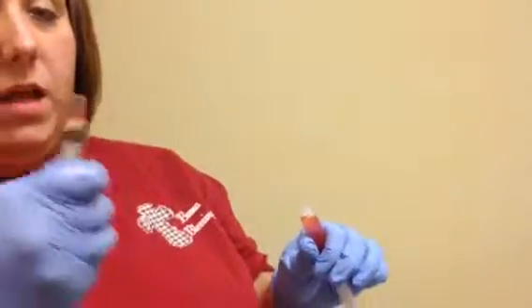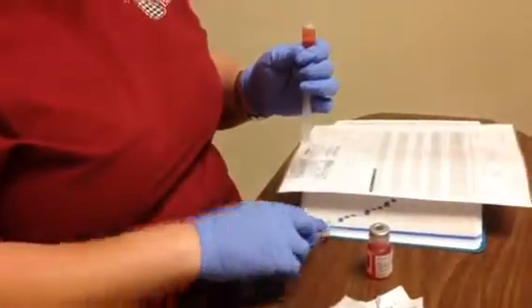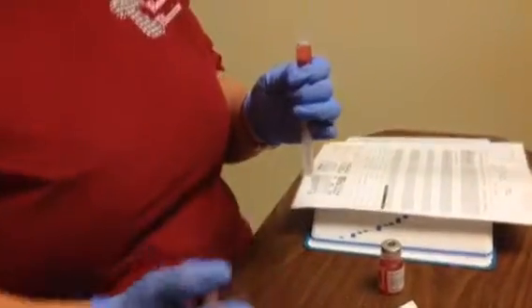Okay, activate your safety device. If it were to be a blunt tip needle or something like that, you can always do your little scoop method. This will go in the Sharps container.